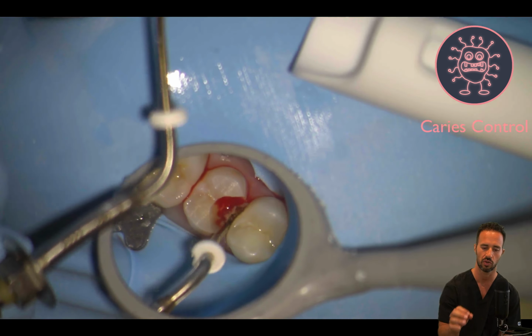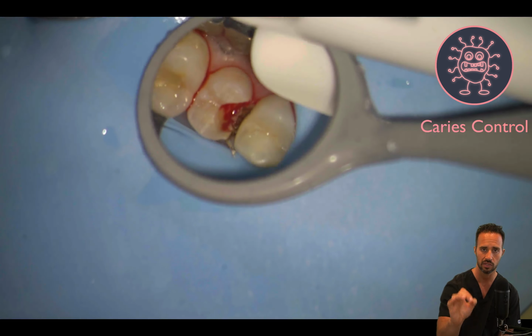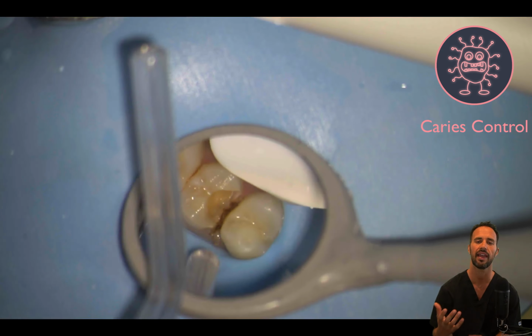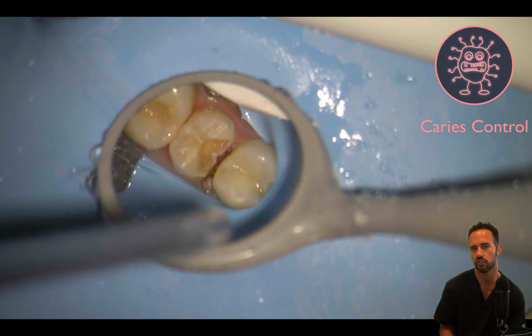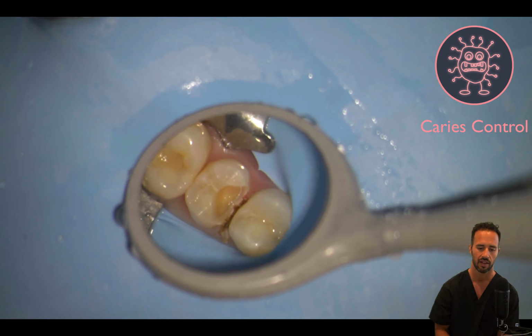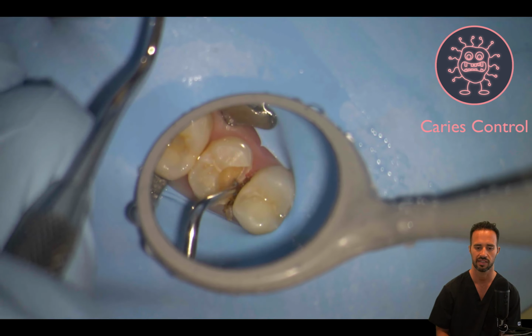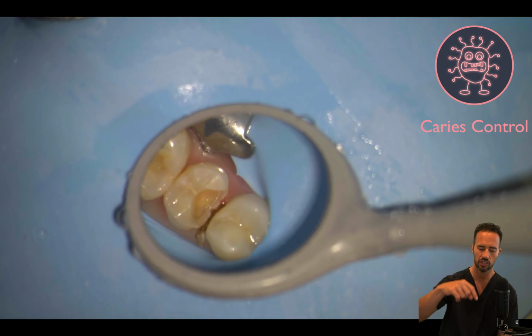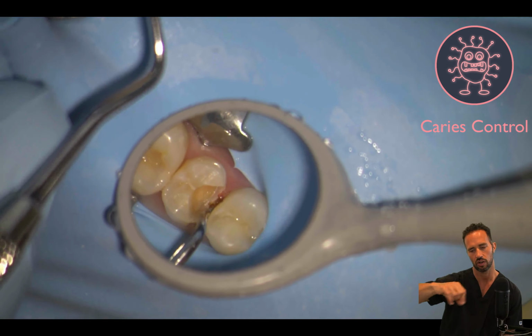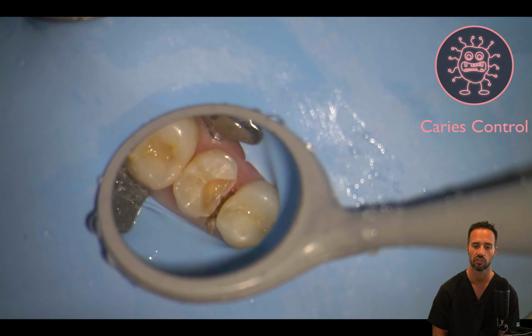from the gingival tissues. So I like to use the System B with the fine medium 08 tip, that heat source, to cauterize the gingival tissues to get a nice dry area. It's like a crude gingivectomy, if you will. If you have a laser and you want to do that, go right ahead. I just keep that on hand, and I'm going to use it anyway later in the procedure, so it's nice to have. And I just pass that along the area where it's bleeding and just cauterize the gingival tissues and remove some of that excess inflamed gingival tissues, right?